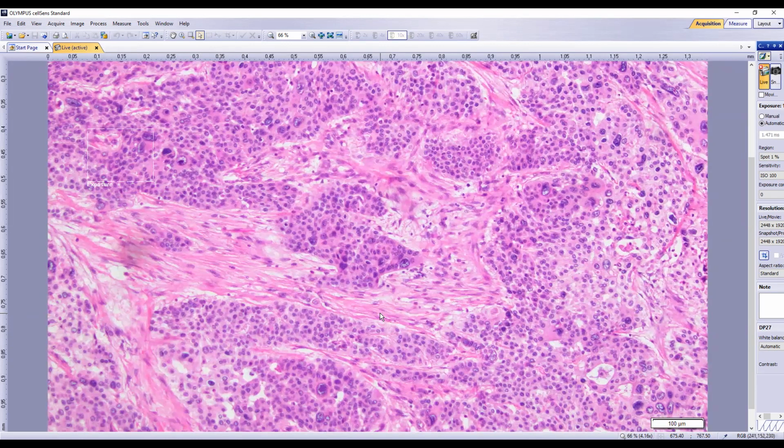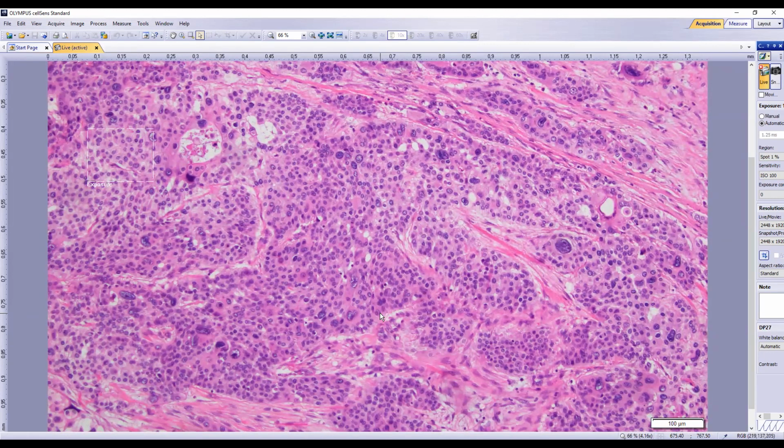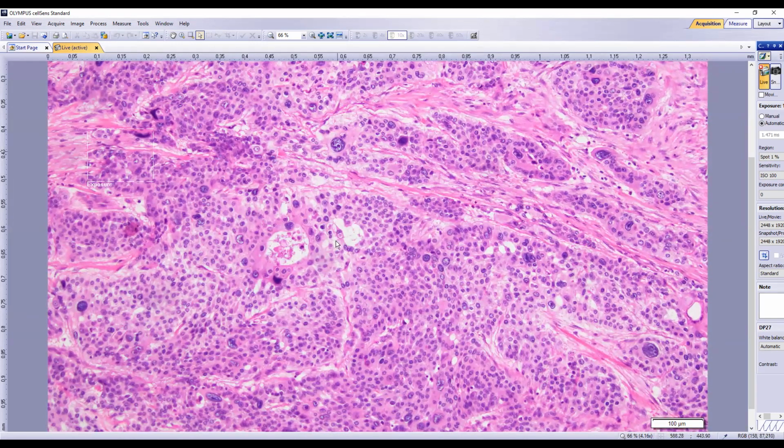Neuroendocrine is a good thought, but a lot of times when we are faced with that, do you really see this many ugly nuclei in neuroendocrine differentiation? Then it would become a neuroendocrine carcinoma, right? We did a P40 stain to support our diagnosis and it was strongly and diffusely positive, so we went with adenosquamous carcinoma. Right.